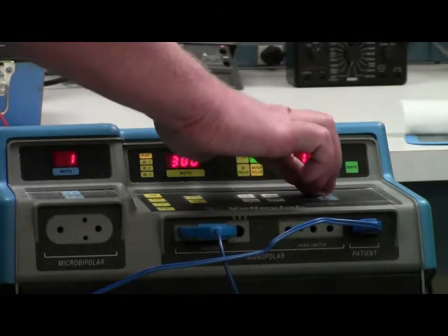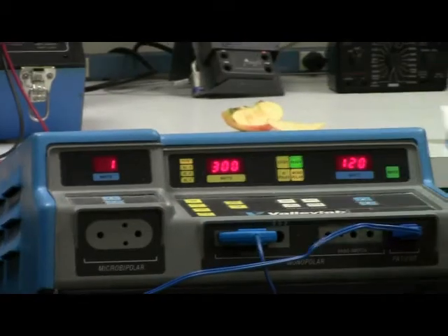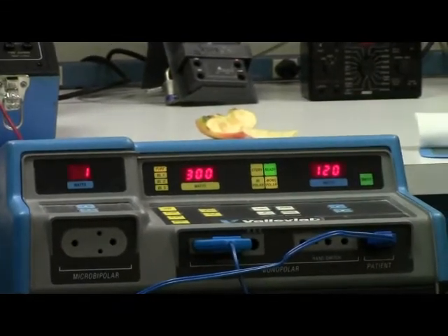Ted is going to adjust to the 120 watt setting. Of course, the actual control is set for the accessory side, which is for the foot switch.